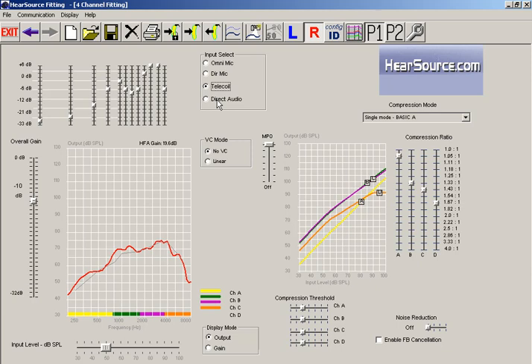Now the last input is the direct audio. The direct audio typically has to use an external auditory source and something has to connect into the hearing aid such as a boot or a wire of some sort. Usually this is used with either an FM system, I've seen Bluetooth, things like that. Most of our HearSource products that are available don't use the direct audio system.